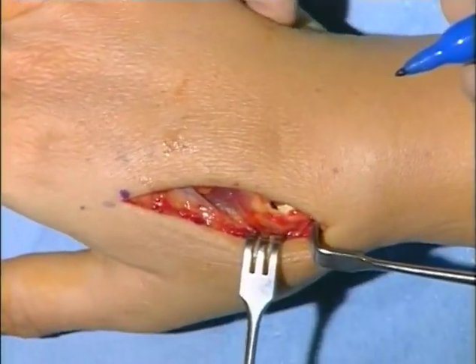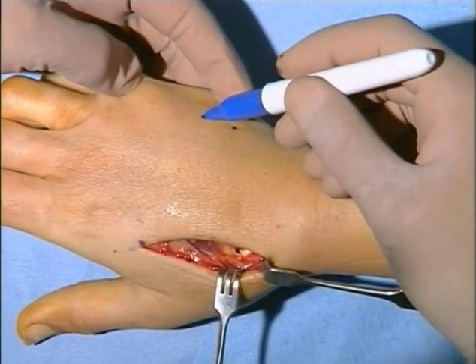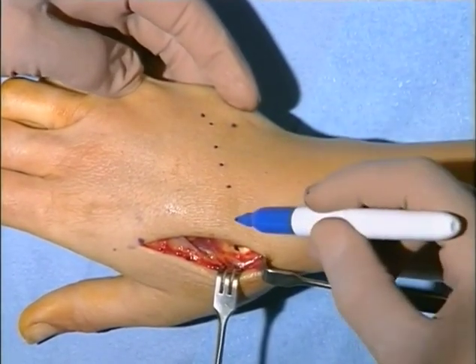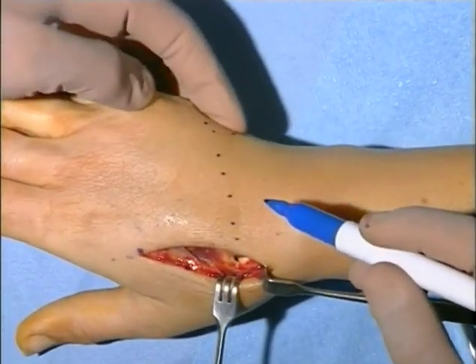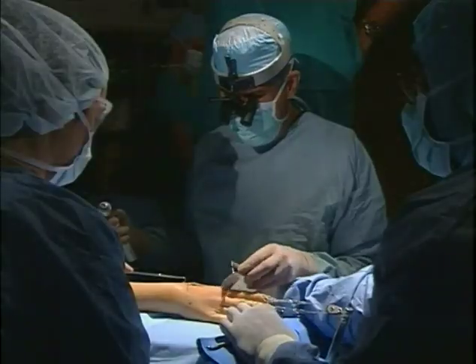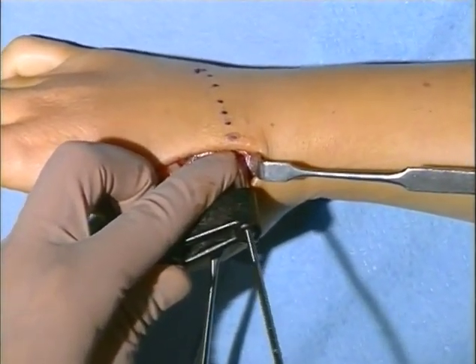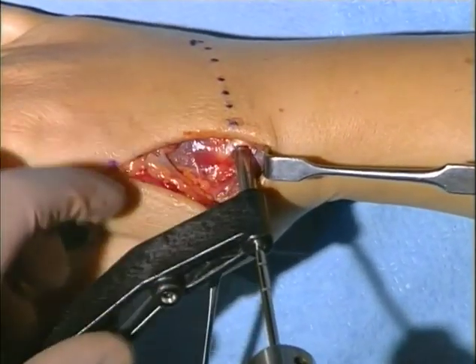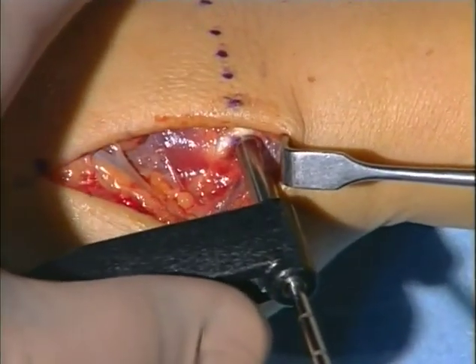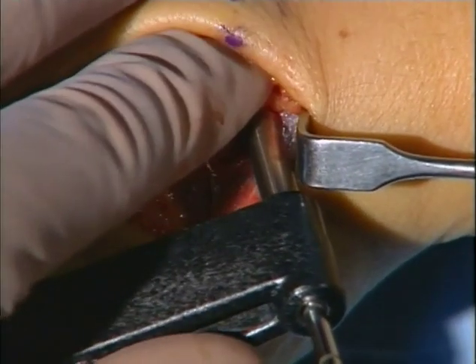For orientation purposes, we'll put a little dot on the point of insertion of the pin. By palpation, I'll feel the carpometacarpal joint and place a dot there. This would be the proximal third of the little finger metacarpal, and we want to insert that pin along a line extending from the base of the index metacarpal on its radial side towards the proximal one-third of the little finger metacarpal. We place the drill guide on the insertion of the radialis longus tendon, aim across the plane formed by the finger metacarpals towards the base of the little finger metacarpal, and drill the pin through the base of the index metacarpal into the base of the long finger metacarpal.